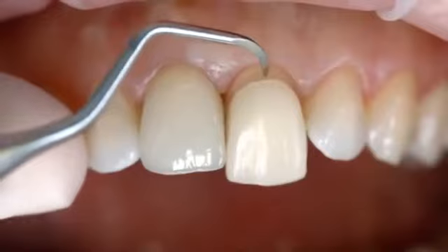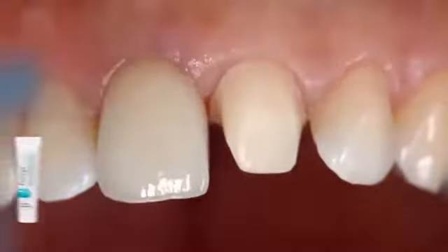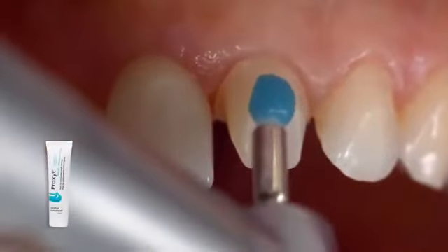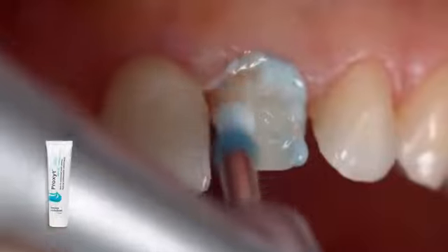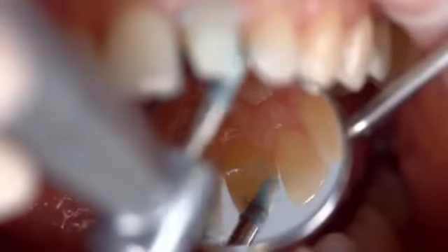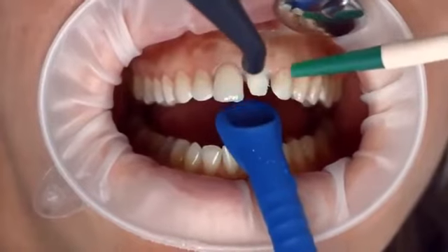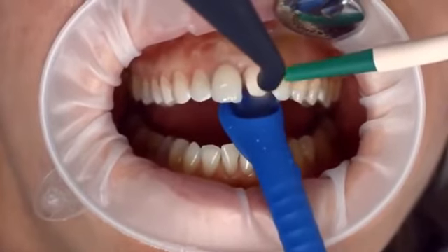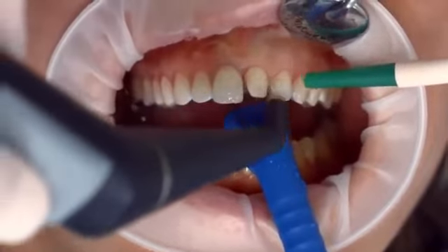Remove the temporary restoration. Clean the preparation with a polishing brush and fluoride-free cleaning paste, such as fluoride-free Proxyt. This ensures that all temporary cement residues are removed. Rinse the preparation with water spray and dry it with water- and oil-free air.